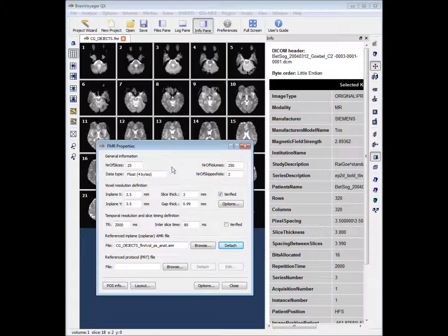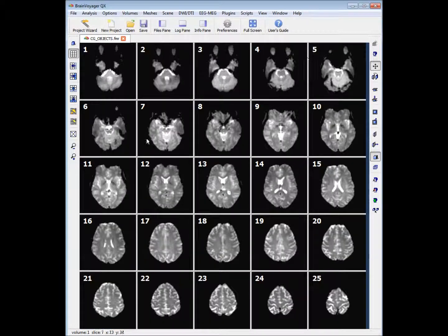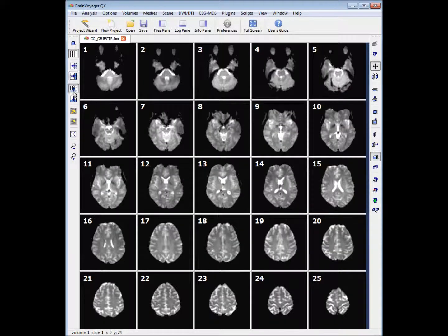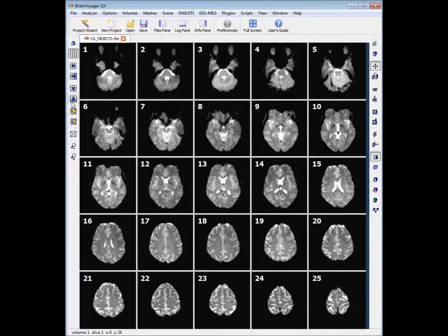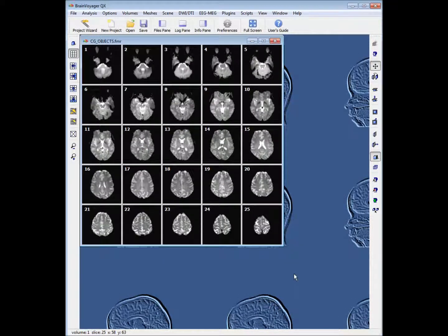We can close that and close the info pane. We can also change the display — for example, changing the number of rows and columns, zooming out, or zooming in. And that covers it — that's the conclusion to project creation.